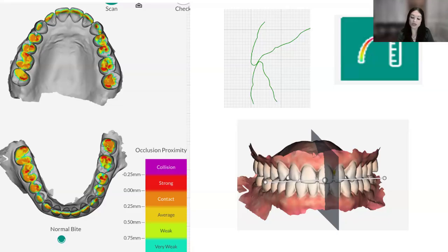Well, within the software, there's a button. With soaped models. Do you remember that? So we soaped the models so that they were white and bright and shiny to treatment plan along with the photography to the patients. So this is sort of like AI of that physical work we did for years, right? That literally took hours to do. Yeah, I agree. And I'll show you another image of that at the end.